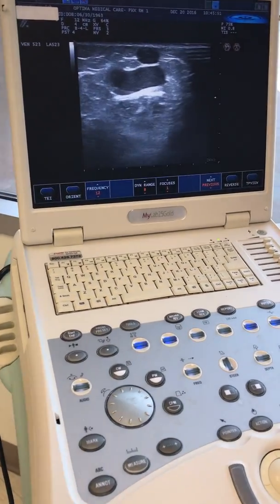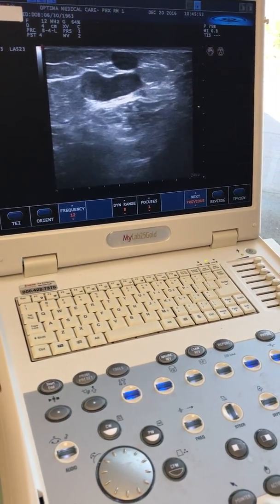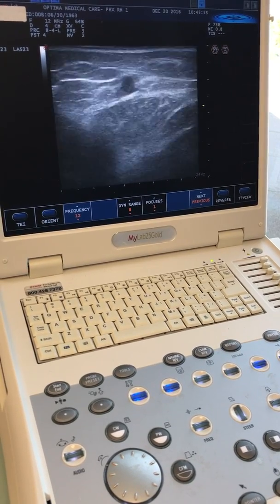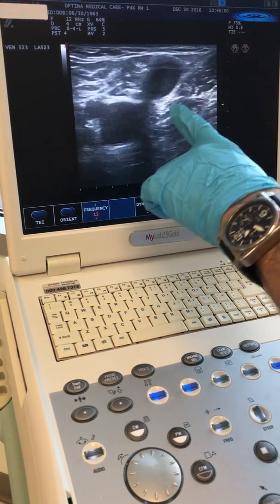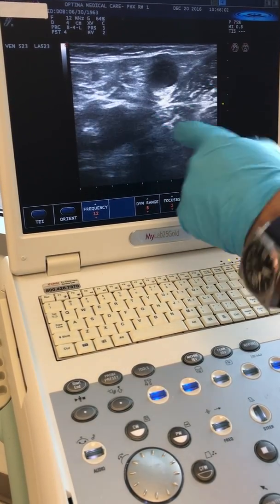I've got a young patient here, and I treated her daughter-in-law previously. What we're looking at here, based on the ultrasound, this is how we determine who needs treatment.